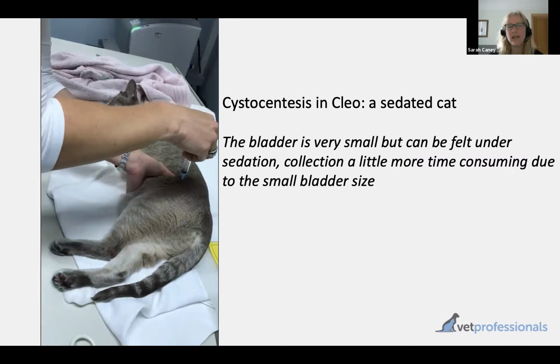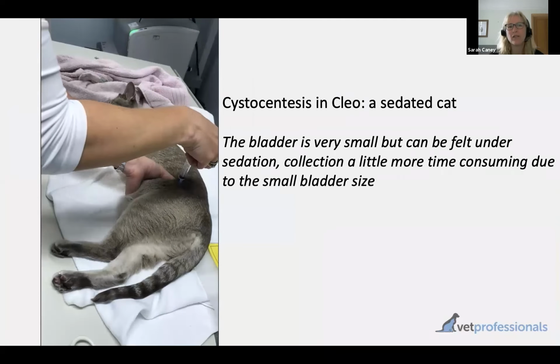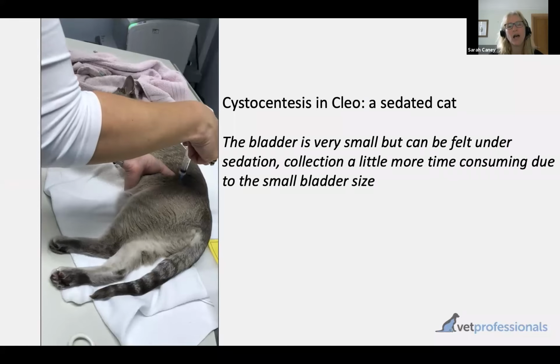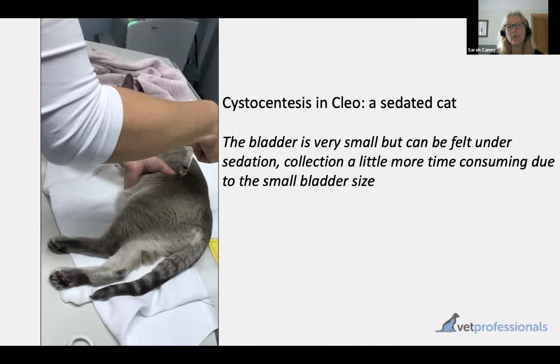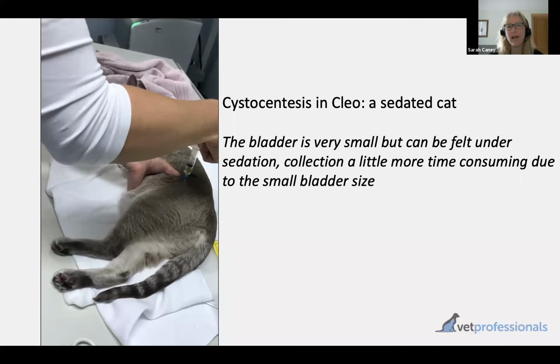But this is again an example of a lateral cysto where this cat had a very small bladder, so you can see it actually does take a few seconds to fill up my syringe. But again, I'm feeling the bladder, I'm stabilizing the bladder, then introducing my needle through the skin, perpendicular to the skin, all the way up to the hub, and then aspirating a sample.